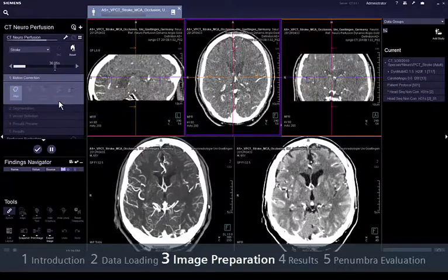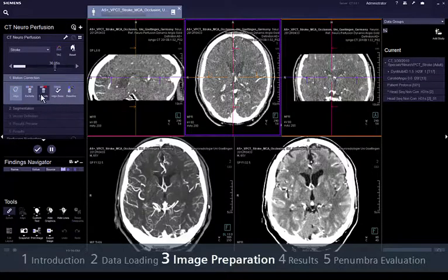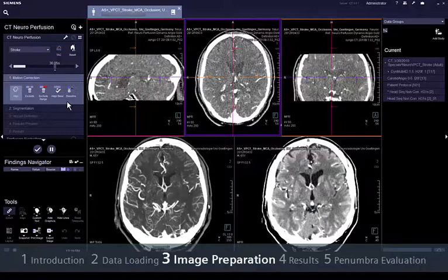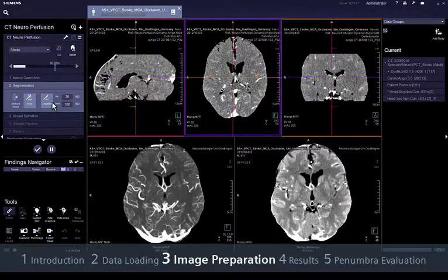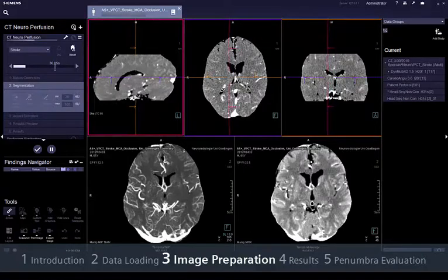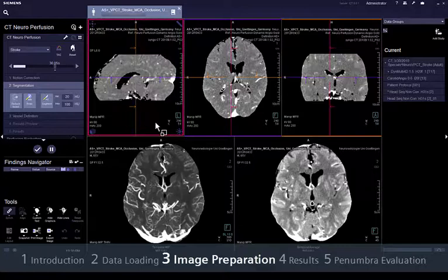If motion artefacts are observed in some time points, it is better to remove the corresponding points beforehand. After optional motion correction and deletion of critical time points, go to step 2, segmentation, where the 4D noise reduction can be run to reduce image noise. This is especially helpful if the data is noisy due to a protocol with low mAs.